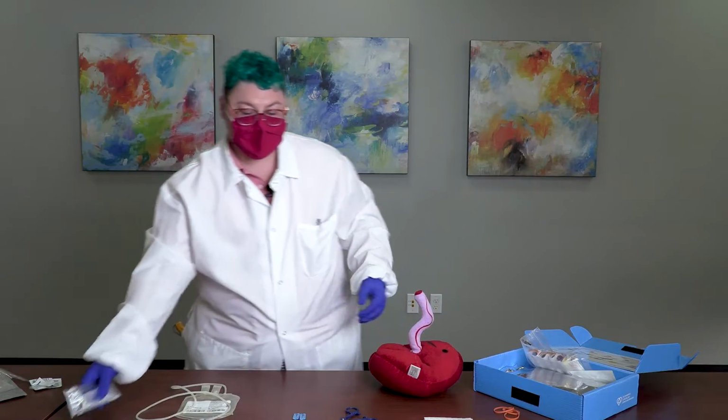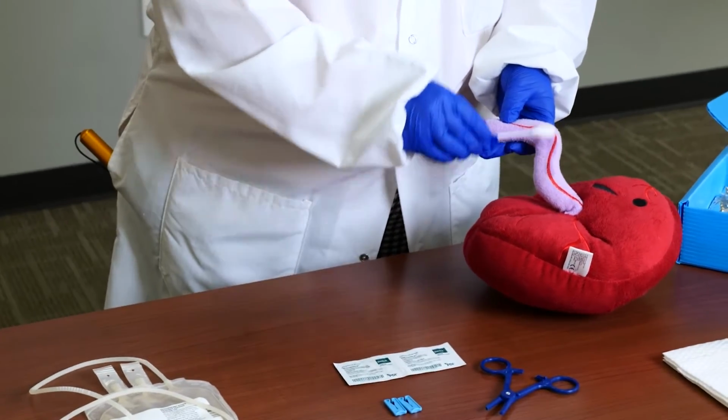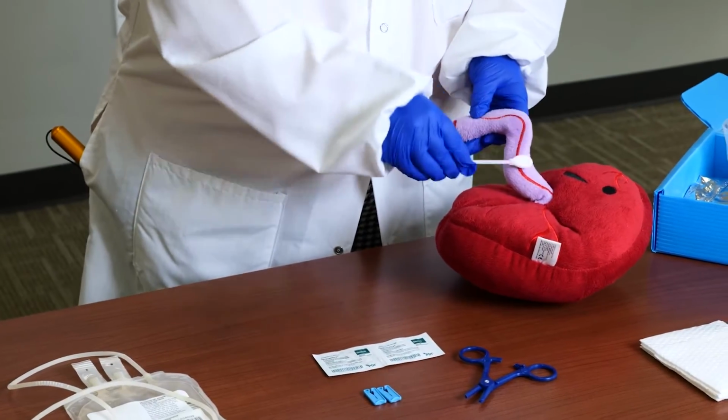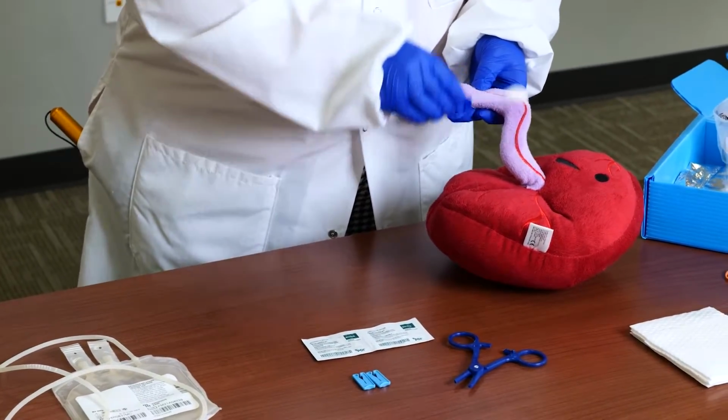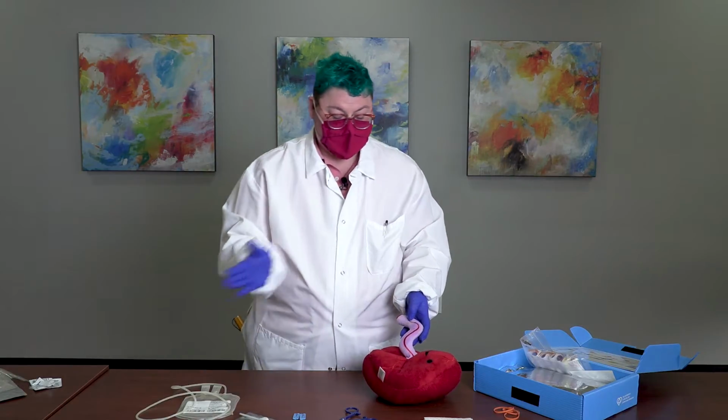The next step is to use a ChloraPrep swab stick. The ChloraPrep swab stick must be cleaned at the venipuncture site for 30 seconds. Once 30 seconds have elapsed, we recommend letting it dry for 30 seconds. Due to the prevalence of delayed cord clamping, we do recommend that this cleaning process occurs prior to clamping the umbilical cord, since the cleaning and drying takes about 60 seconds.